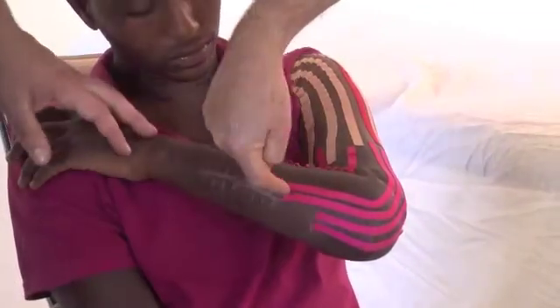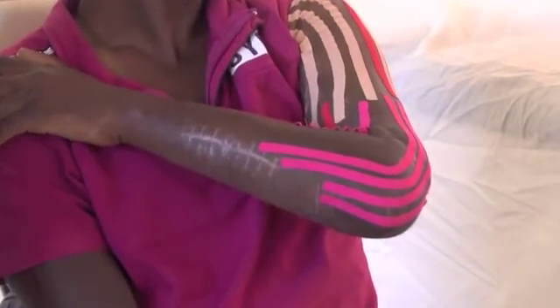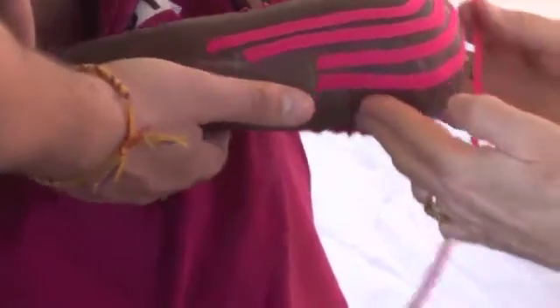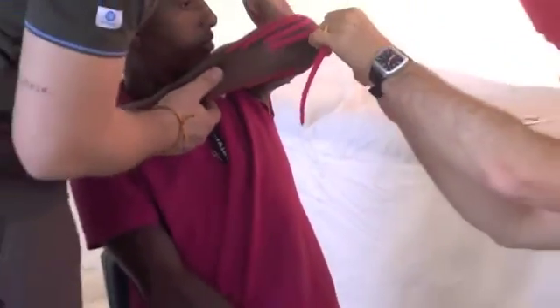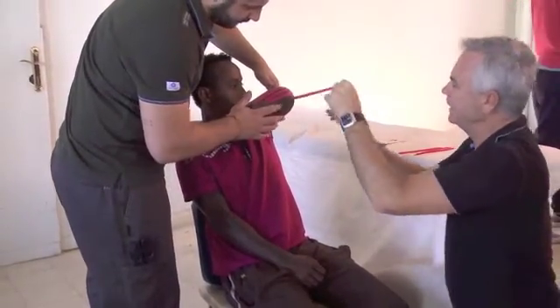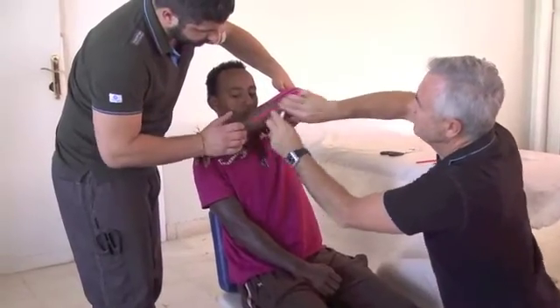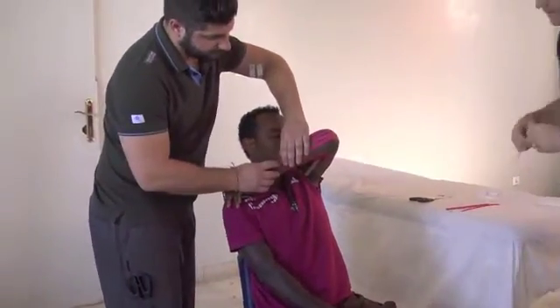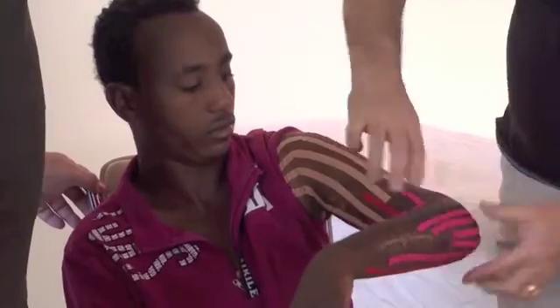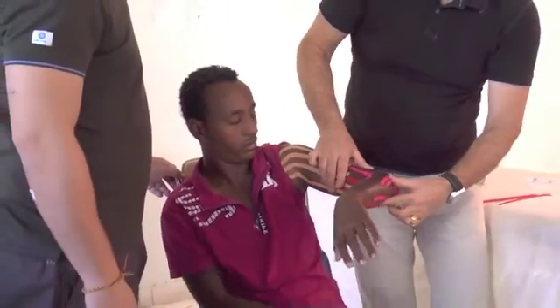You see how the tape is in this form — the tape is in this form because the tape has done different directions, different distances. We are going to start just as before: take off the paper and then apply in this direction. Now when the patient extends, you see the starting of the dilation process.